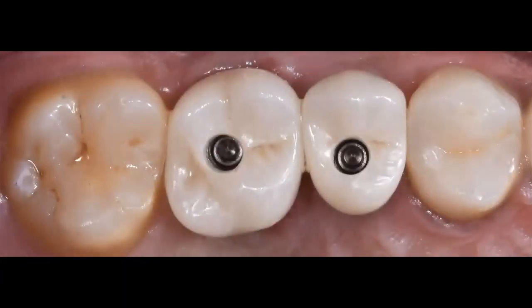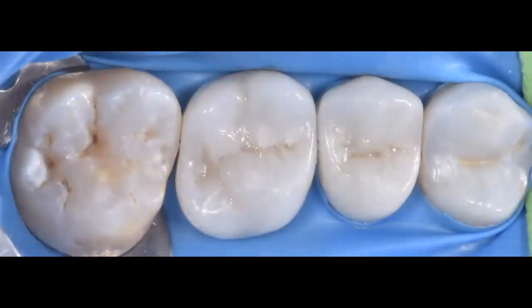They are the crowns, fully seated, torqued, sealed, the access, and I was done with the case.